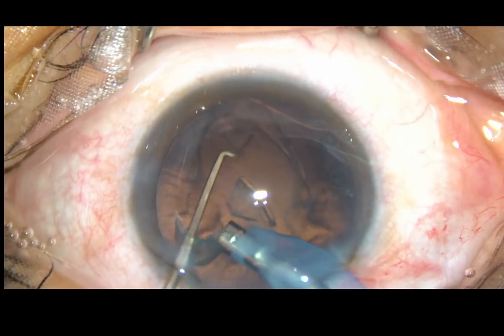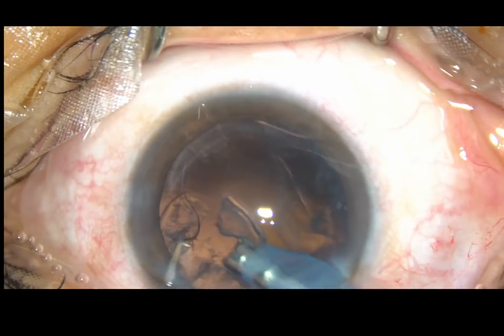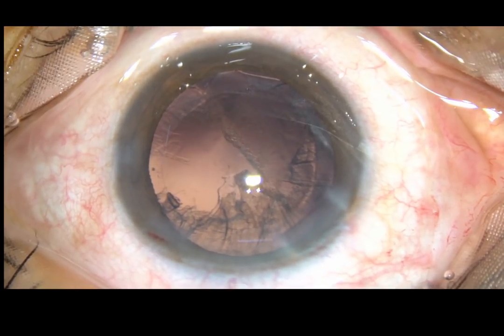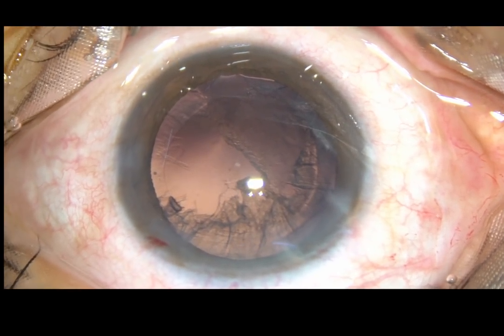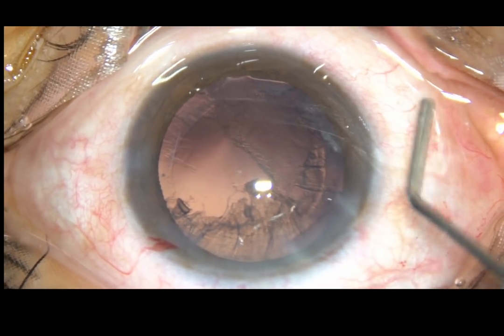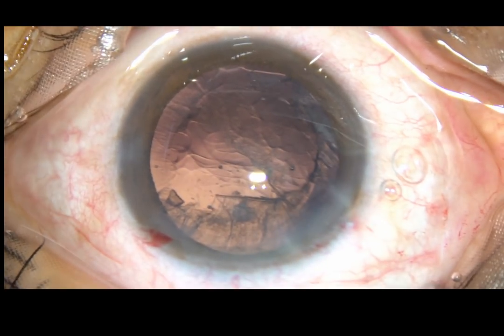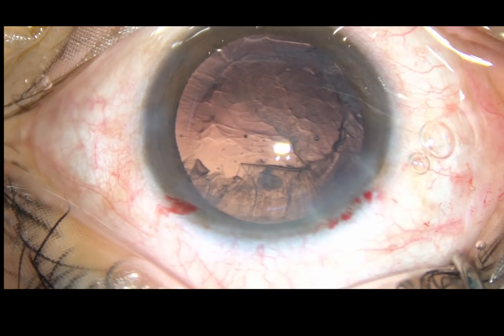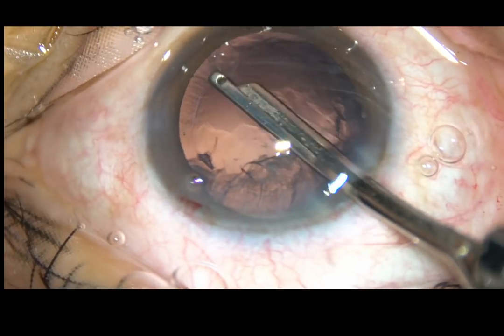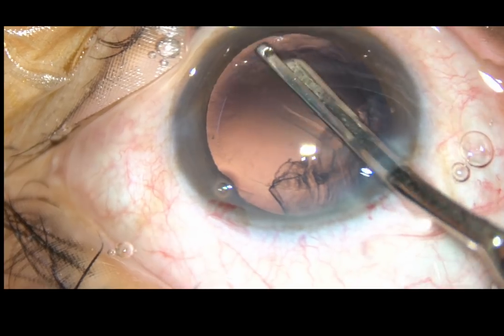Now, this is the epinucleus. The epinucleus also got removed quite fast in this case. Now, a bit of hydroxypropylmethylcellulose is injected. It keeps the anterior chamber formed and provides endothelial protection. This is a 23G SIMCO being used for removal of the cortical matter.